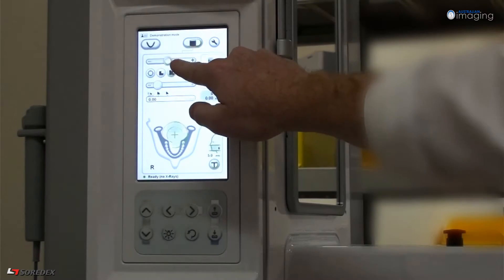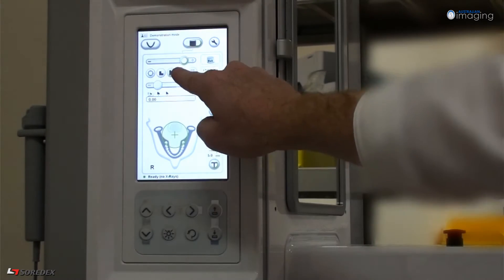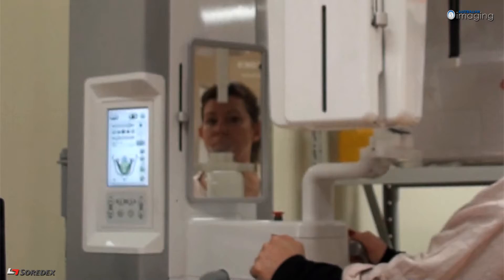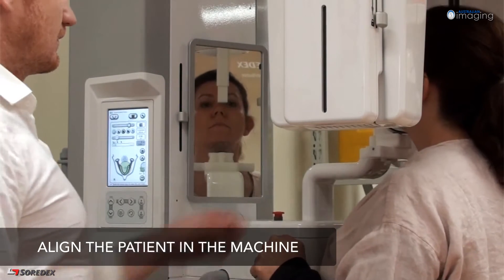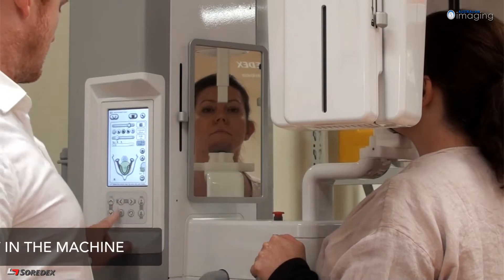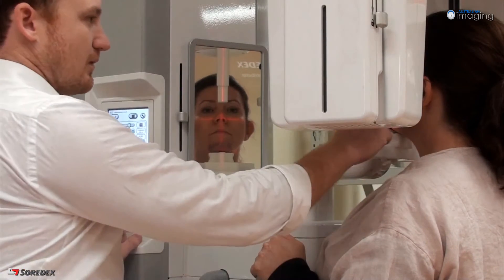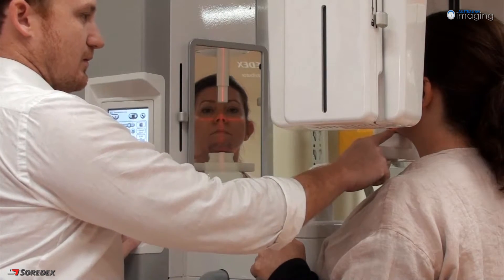Choose your desired field of view, your required exposure level, and then pick your region of interest on the dental arch. Place the appropriate bite piece and chin holder into the unit. Using the manual controls, position the patient so that the horizontal field of view lasers are aligned to your region of interest.